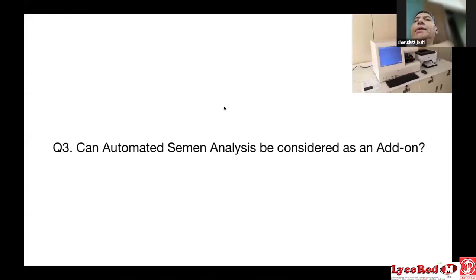observation and under development. Anyway, our next question was related to this automated semen analysis. We consider it an add-on. Definitely, it is going to help us. But the most important question which I want to bring to the notice of the panelists: suppose you have a semen analysis CASA report where they have written linear forward progression, this percent, this much, that percent. What importance or understanding does it give to you as a clinician, if you give this report to a clinician, what interpretation is there?